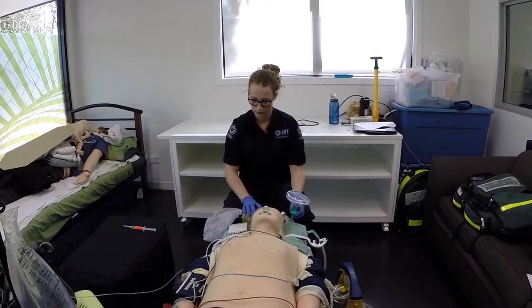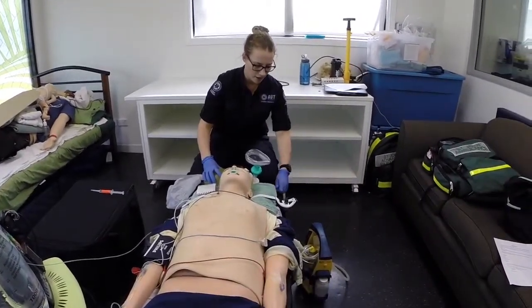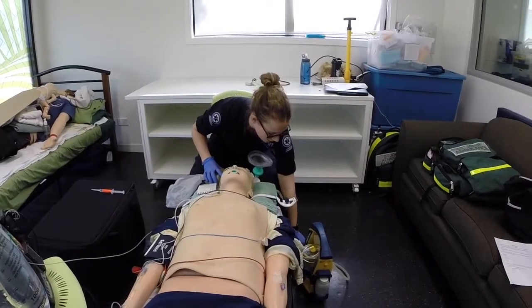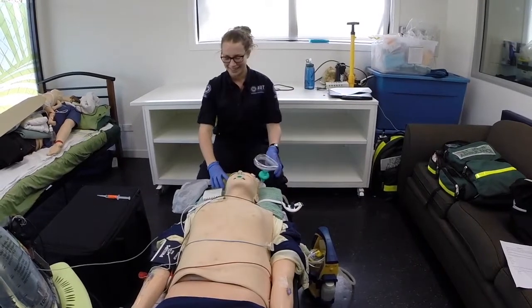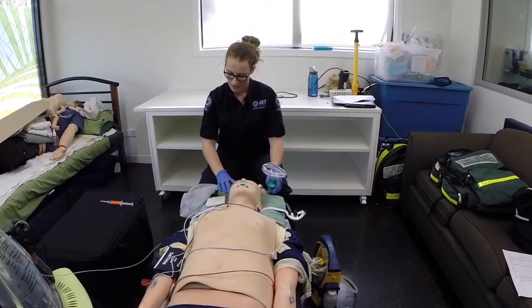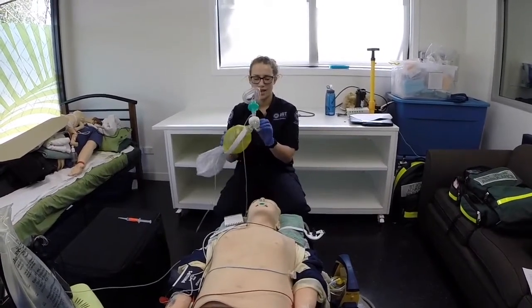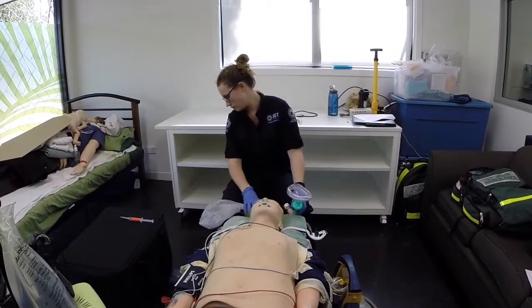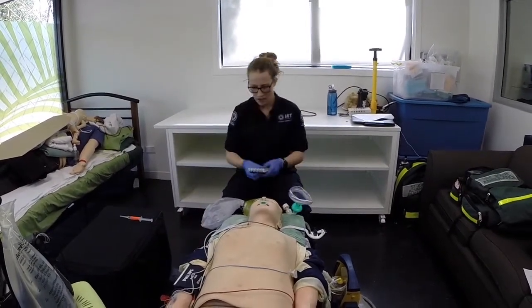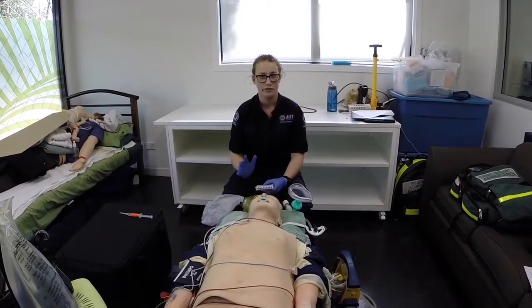Ensure suction is working and place the rigid sucker under the towel. So we've got the rigid sucker under the towel currently, and the suction is working. Prepare a manual ventilation bag with a PEEP valve attached. So we've got our BVM here, and we've got the PEEP set at 5 centimetres of water. Obtain a set of vital signs. Yep, so we've got our monitor to set vital signs at every 5 minutes.